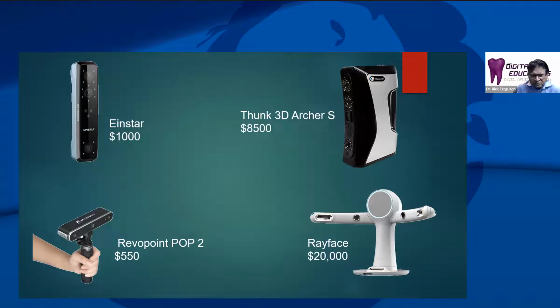And then we have the Einstar, which is a newer machine that came out recently, and we acquired one of these. The difference between the two is a few $100. The Einstar is pretty good. I actually think it's a little bit better than the RevoPoint, but we're still debating that in some ways. The Einstar is definitely a little bit faster as far as the scanning.